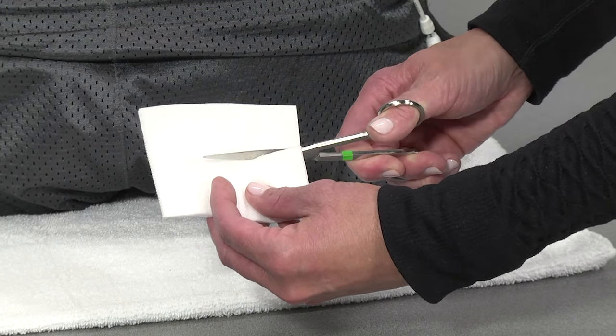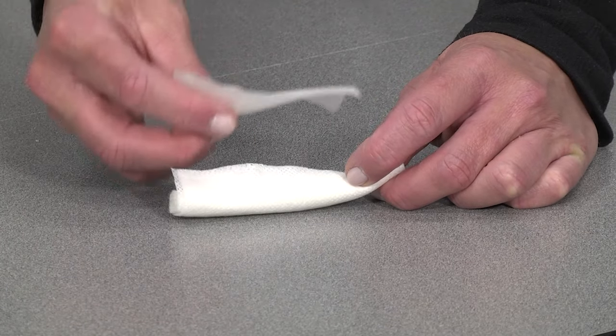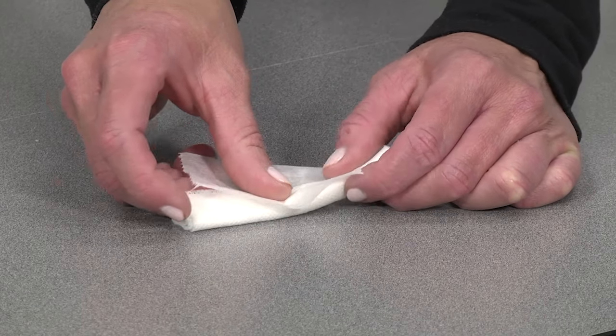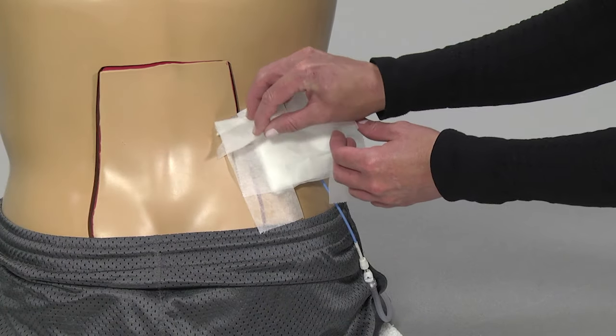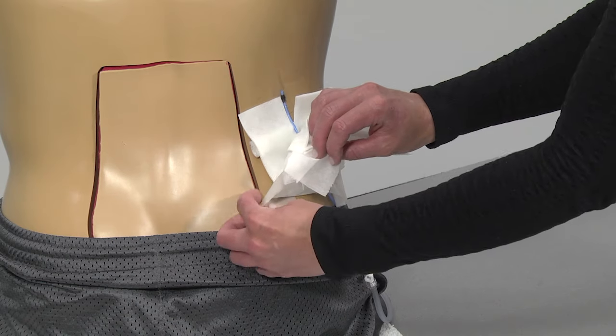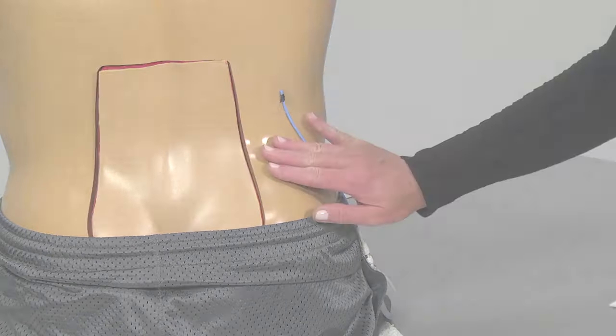If you're having discomfort at the insertion site, you can take another gauze dressing, roll it into the shape of a log. To prevent the dressing from unrolling, wrap a piece of tape around it. Remove and throw away the old dressing. Be careful not to pull on the tube or your skin. Inspect the insertion site for signs of leakage, redness, drainage, foul odor, or swelling.